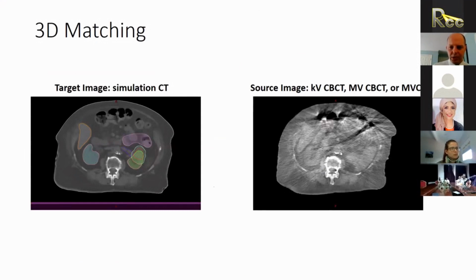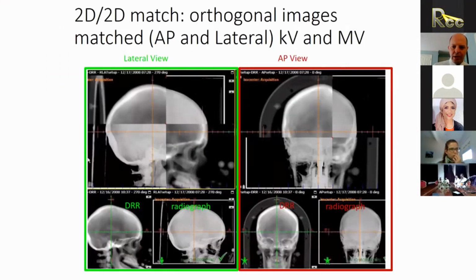For the 2D imaging, in my experience, it will account for it for your image. If you have these two images, it will account for it for this image because you can basically rotate this image to account for your couch rotation, but it won't account for the rotation in your lateral image. So it might work for very small couch rotations. And honestly, if you have larger than that, then you probably have some other issues. It really should only be small rotations that you're worrying about.